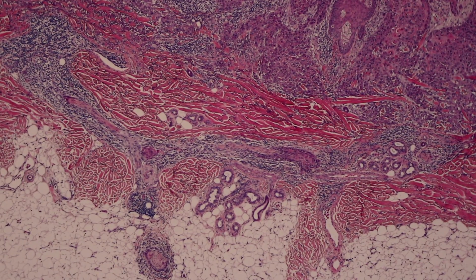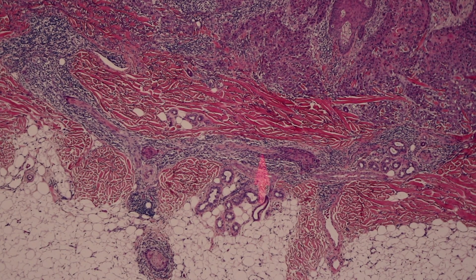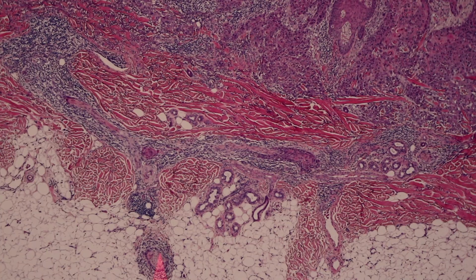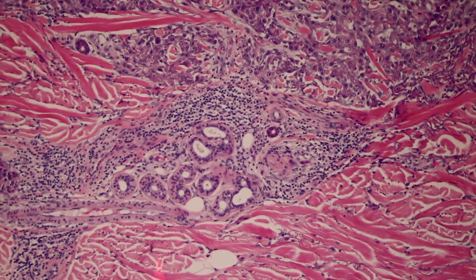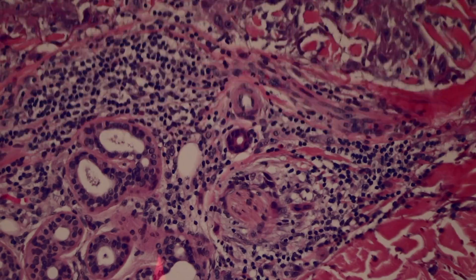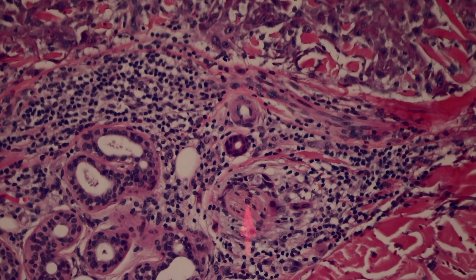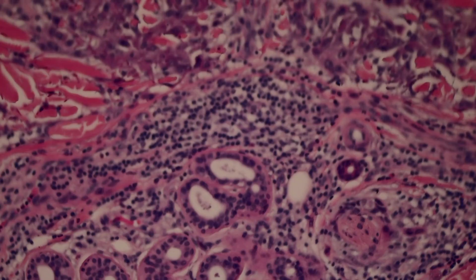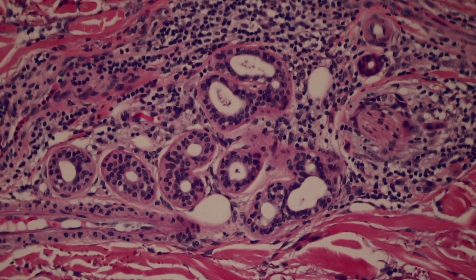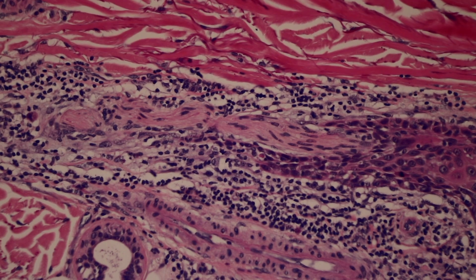And you can see here's the tumor invading, and then right down here, here's nerve, and then the nerve tracks down into the deep dermis, and there's tumor around it at all of those points. So this is the same nerve. It's waving and coming in and out of the plane of section, and so that's why we're not seeing all of it. You have to think in 3 dimensions in pathology. So there's tumor right here, and there's nerve that it's wrapped around. These are eccrine coils, sweat ducts, or sweat coils, excuse me. And then here's tumor right here, and again, tracking right along the nerve.